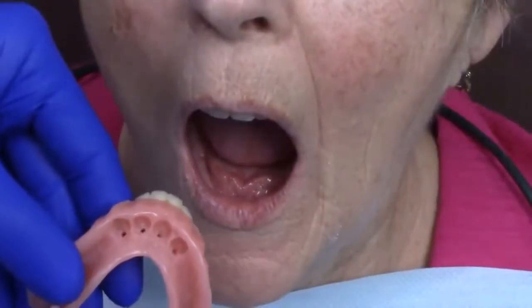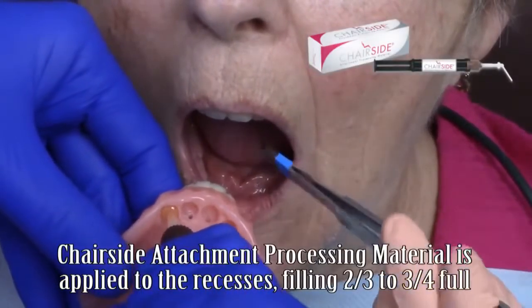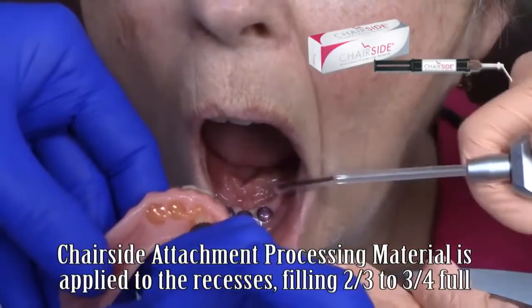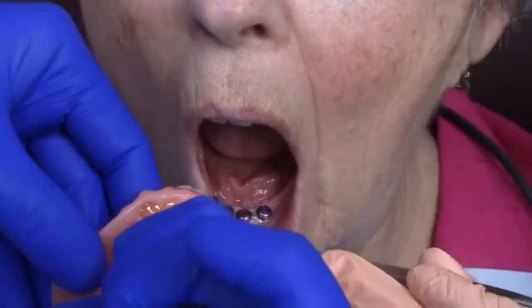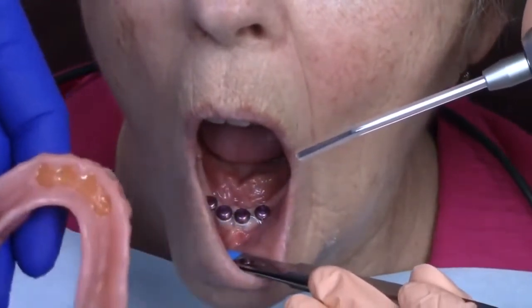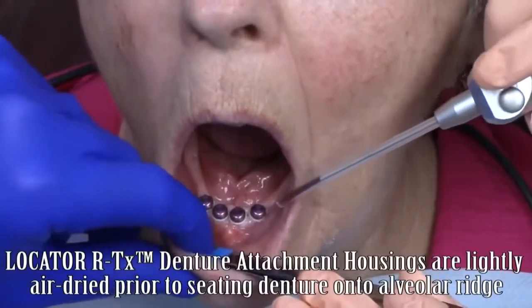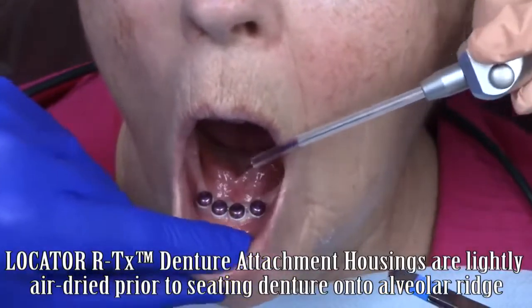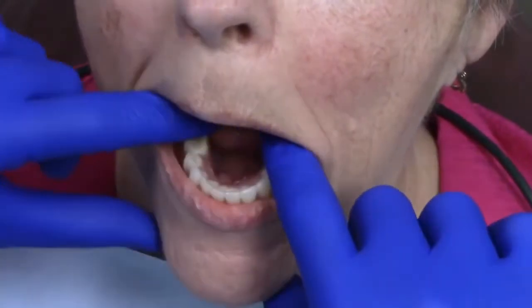Chairside attachment processing material is injected into the recesses of the complete denture, filling the recesses approximately 2/3 to 3/4 full. Notice that I did not need any sort of primer or bonding agent for this material to properly bond to the denture. Once applied to the intaglio surfaces of the denture, the Locator RTX housings are lightly air dried prior to seating the complete denture back onto the edentulous ridge.